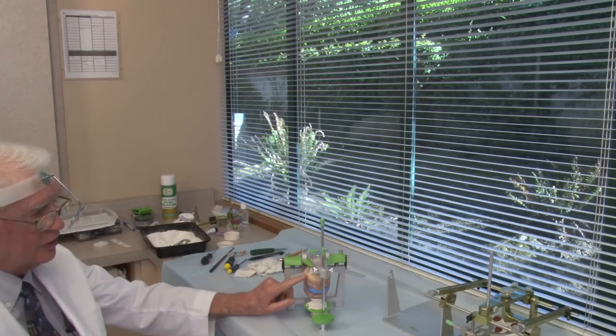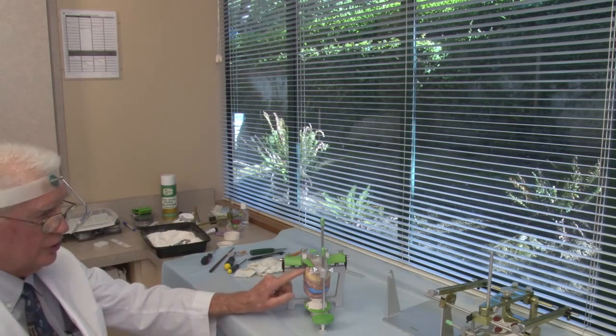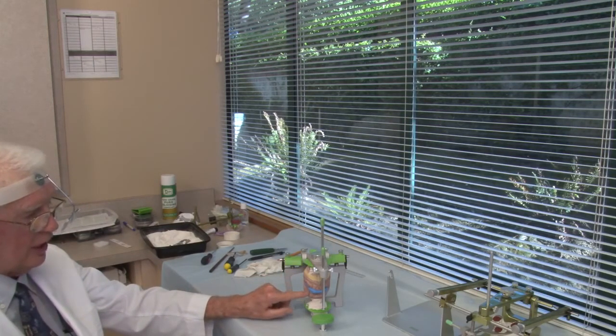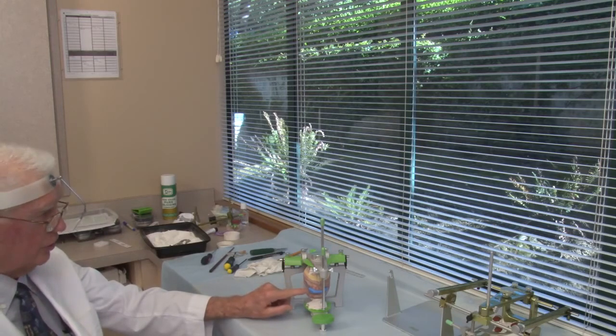We first split cast the mounting of the upper model to make sure the upper model didn't move. Now we're using the same split cast to check the accuracy of the mounting of our lower model to this set of wax bites. And it did not move. So the mounting is good to this set of wax bites. This is a good mounting.